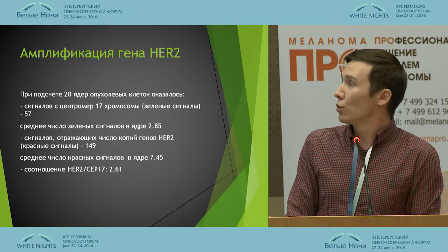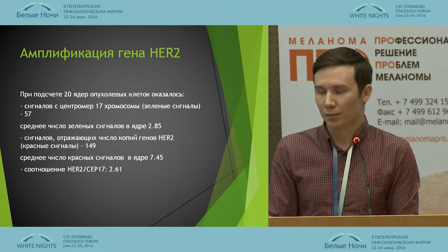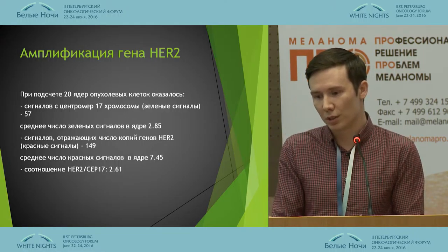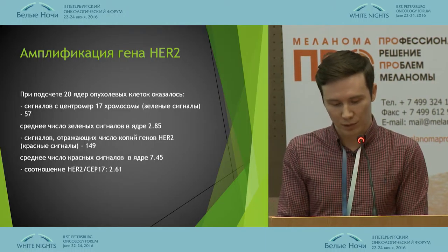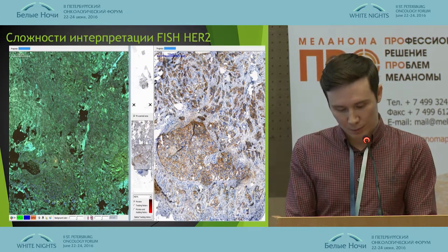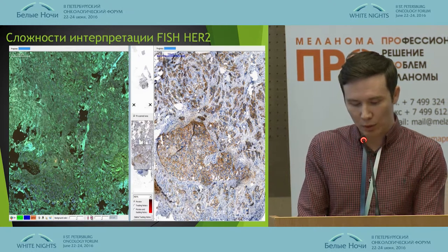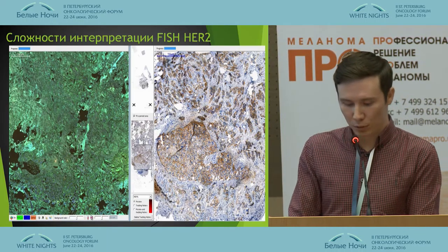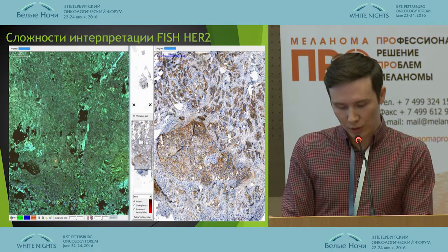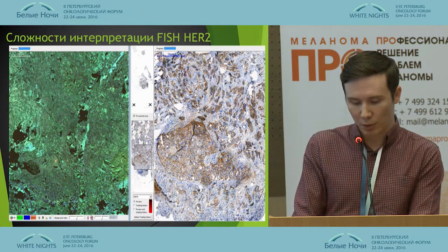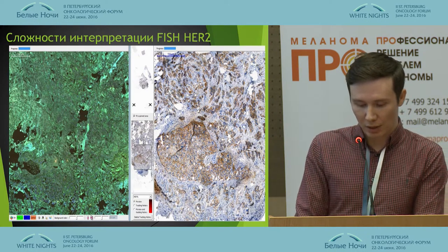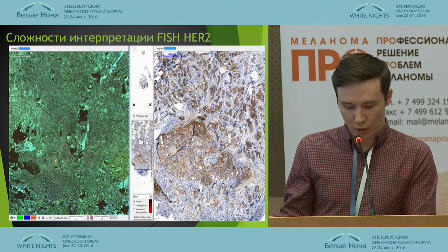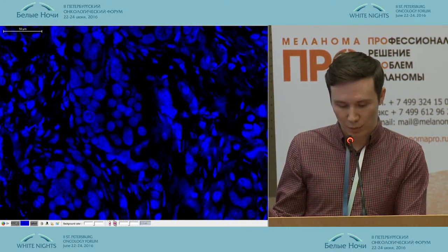We calculate the number of signals with the copies of HER2 and the general picture looks like this. In this case we have amplification of the HER2 gene with 20 tumor cells, with six red signals and a ratio of 2.61. As already mentioned, the analysis should be performed in the invasive carcinoma section. In a fluorescent scan it is difficult to view the carcinoma in situ, and that is the advantage of the digital scanning microscope, as it helps us to calculate correctly.